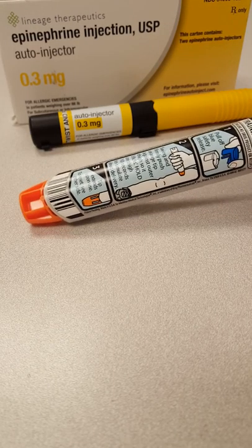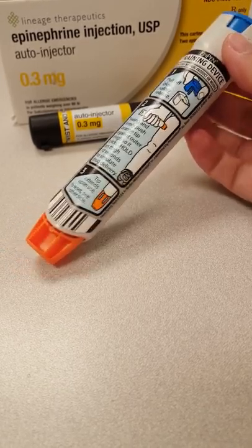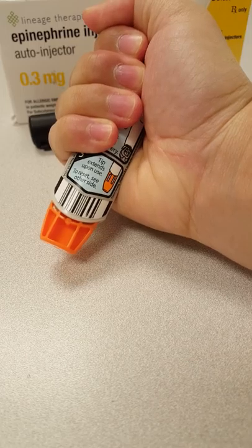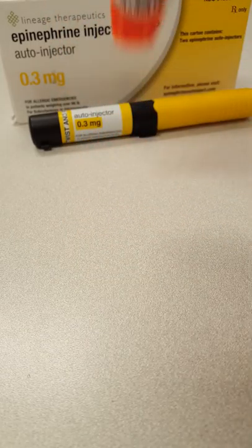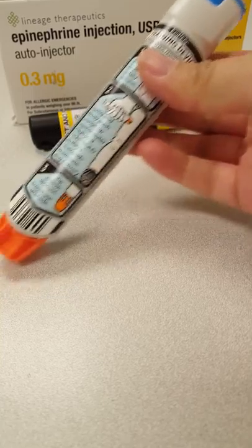First off, with the training pen, the way that you want to grip the pen is just like this, because this is the best way to hold it. You're going to inject it quickly and straight into the thigh.